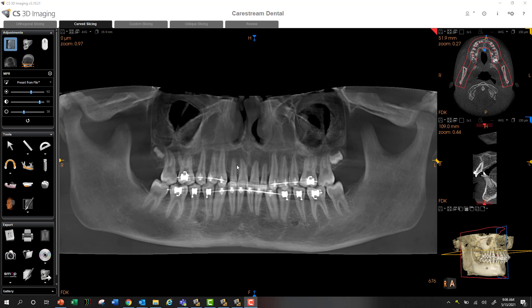First, you just grab a screenshot of this and you can grab your JPEG screenshot. That image will go down into the gallery.